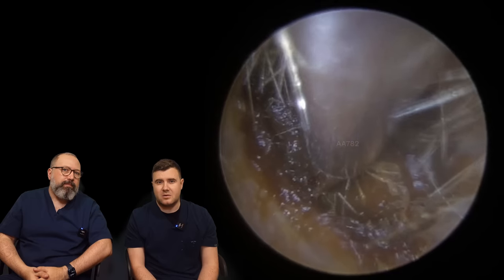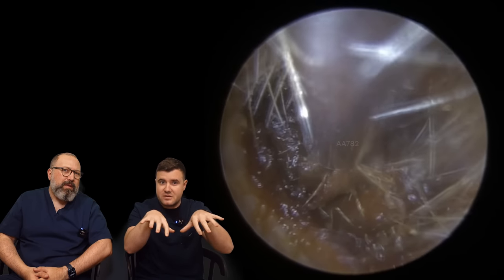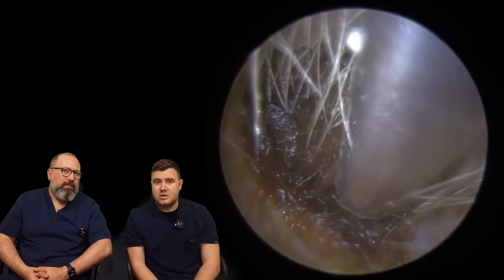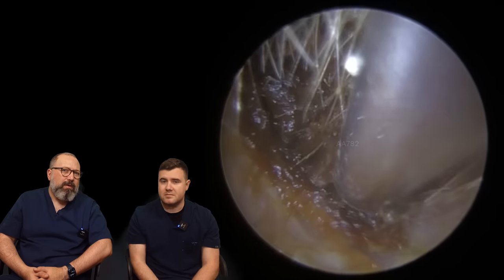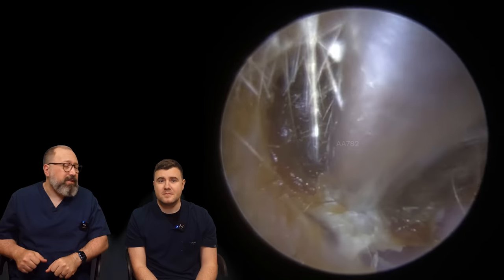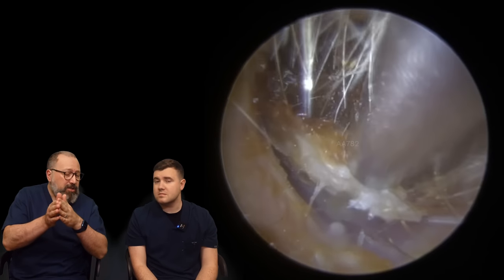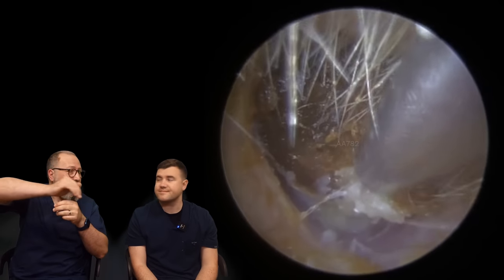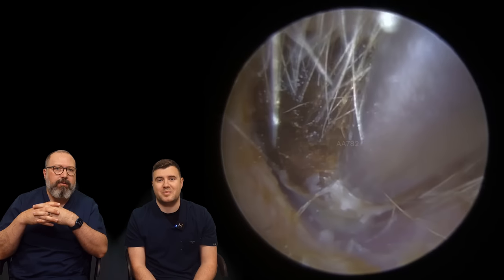I think this is all tacked away in the anterior recess as well, which is that little dip or trench just in front of the eardrum. Very rarely do we actually see people that don't have that trench in front of the eardrum. I had a patient through yesterday whose anterior recess was so pronounced — as much as I tried to push the endoscope around the corner to see the entire eardrum, I could only see two thirds of it. Luckily nothing had gone down in there, but it would be a really difficult case to get that out.